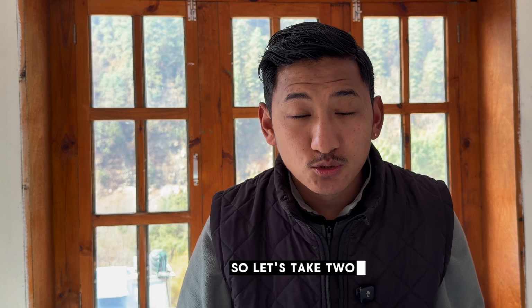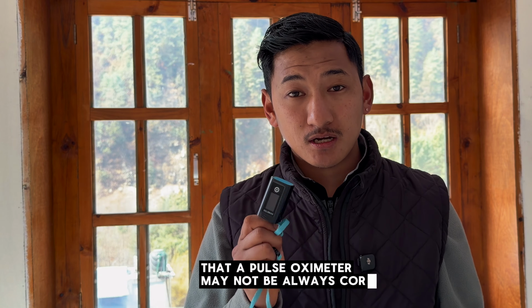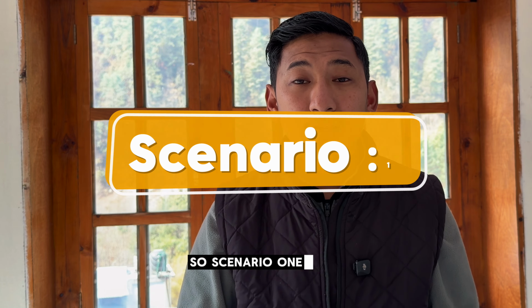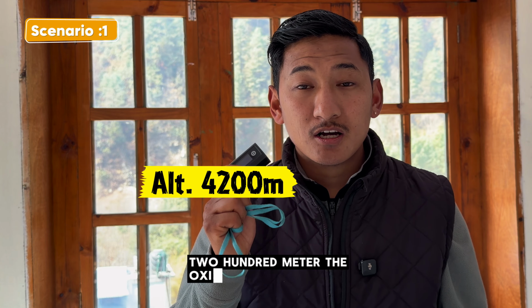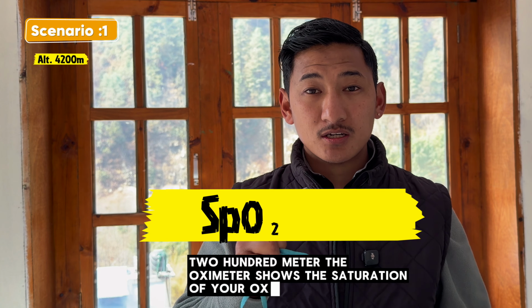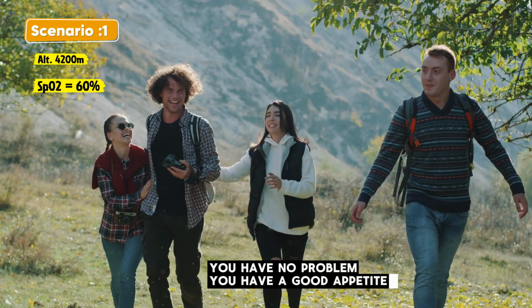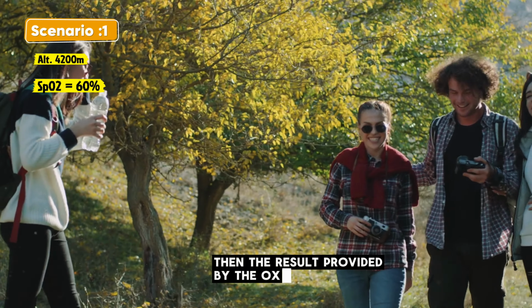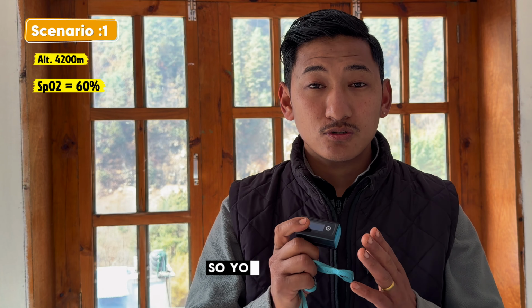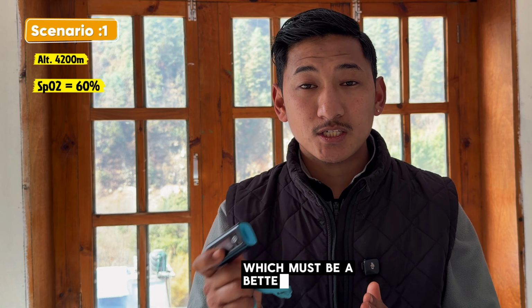So let's take two different scenarios where a pulse oximeter may not always be correct. Scenario one: let's assume you are at an elevation of 4,200 meters. The oximeter shows your oxygen saturation as 60%, but you're feeling very well, you have no problem, you have a good appetite, then you're most likely to be fine. The result provided by the oximeter may not be true, so you should check with a different oximeter, which must be of better quality.